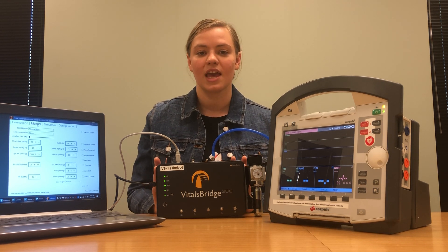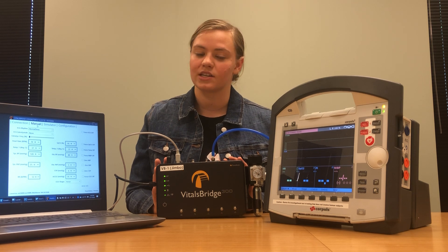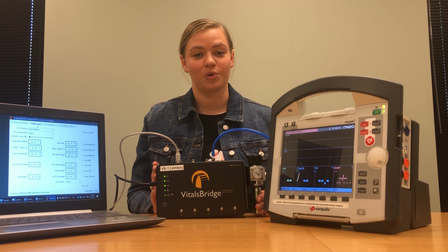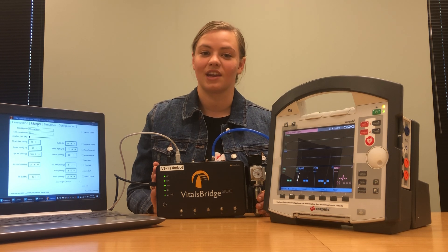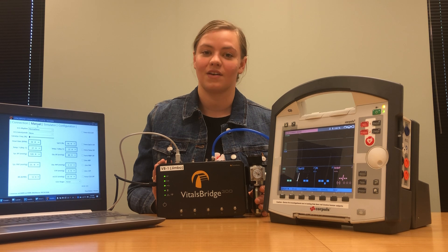You can also use a mobile device — an Android mobile device or a tablet — to connect to your VitalsBridge. To do that, go to the Google Play Store, download the VitalsBridge connector app, and connect your VitalsBridge to your electronic device via Bluetooth.